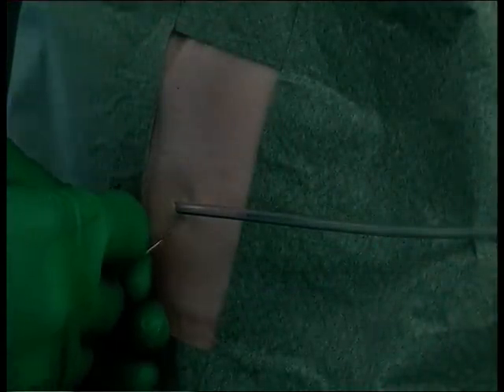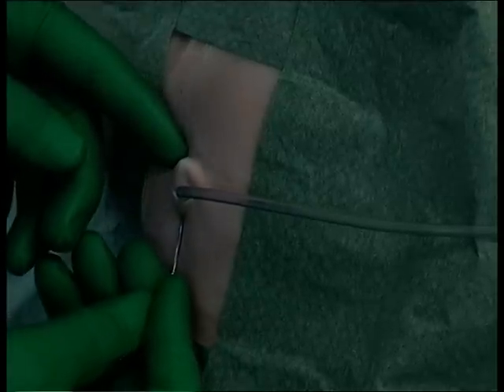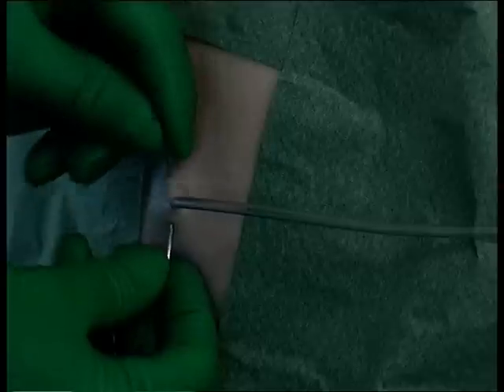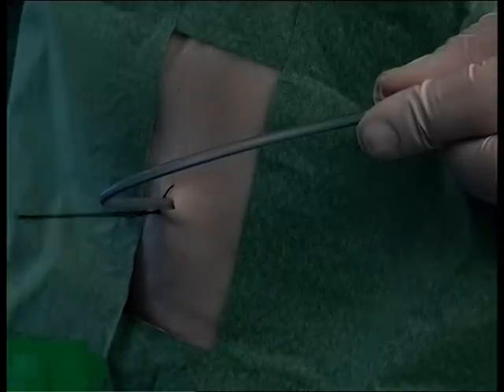Secure the drain with a silk suture on a large curved needle. Avoid the use of gartering as this method tends to slip. Tie sufficient loops to secure the drain without occluding the tube.